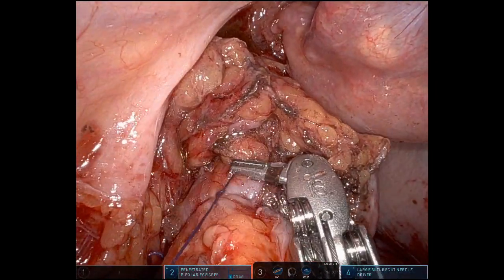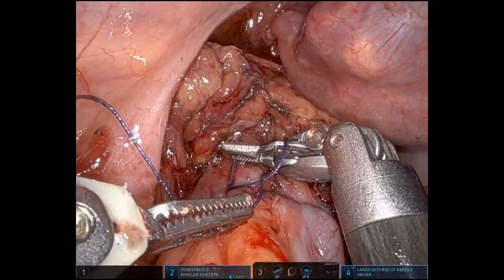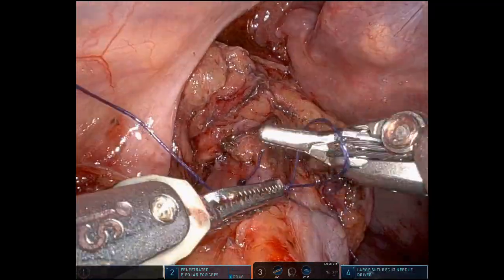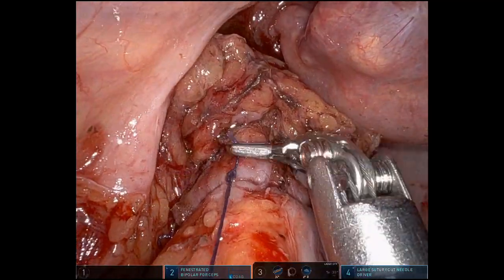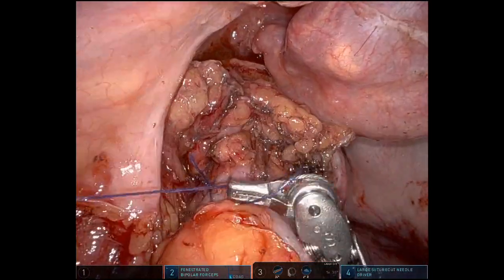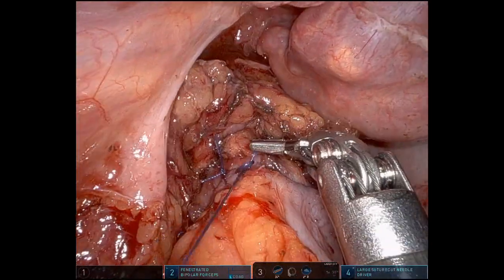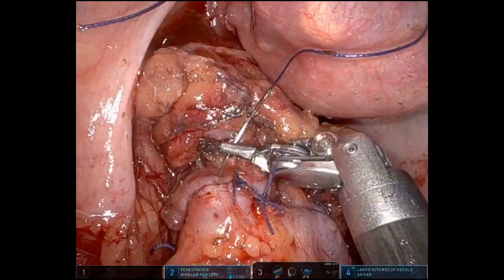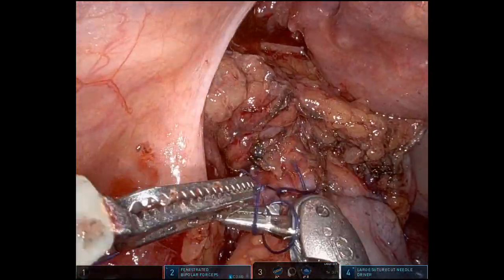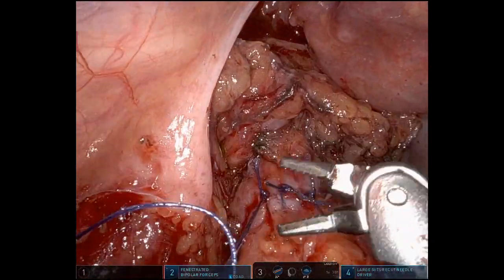You can't really bury that, so we typically just put interrupteds. It is not too uncommon to incidentally find a defect at the anastomosis — that's pretty much why we routinely oversew even after we perform the end-to-end stapled anastomosis. But in a case like this, it's of utmost importance to identify and oversew. So we put three or four interrupted Vicryl sutures right in the middle and right around on either side of that defect.